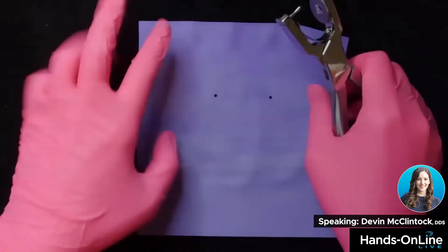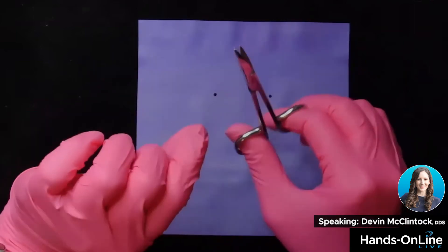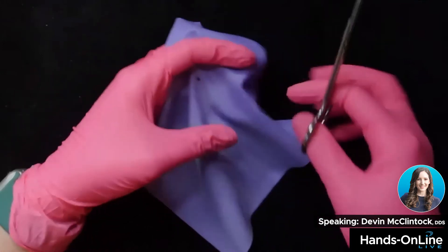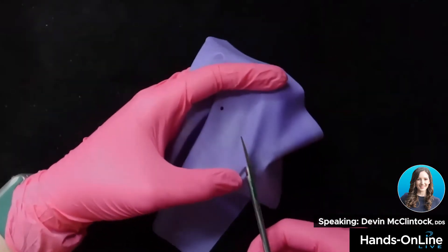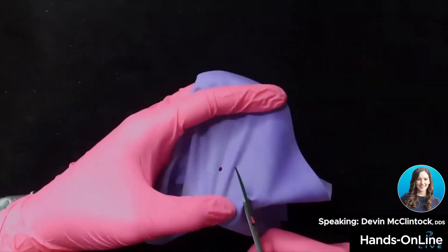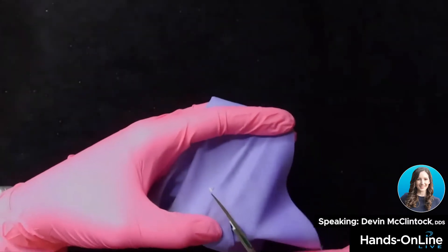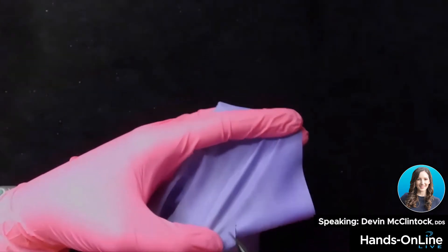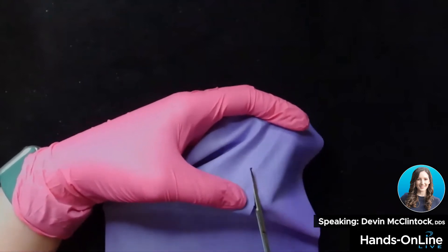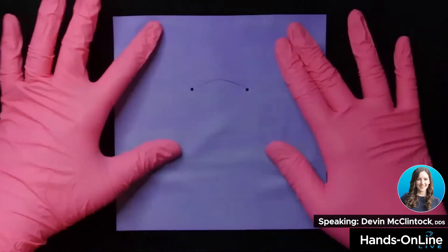Now I have my two holes punched, and this is also super critical — you want to have good scissors, because if you don't, it's going to make your life miserable; it's not going to cut well. You're going to do a low-profile triangle cut, and then literally cut it the other way. It's sometimes nicer to do when the patient is not in the chair, but basically when you're done it'll look like a little stingray.